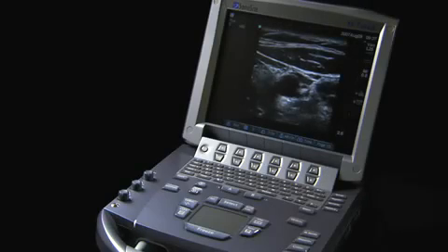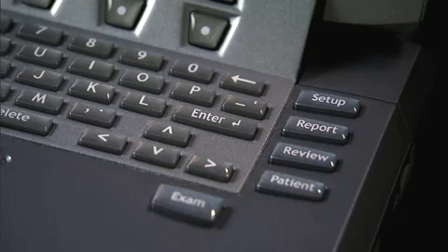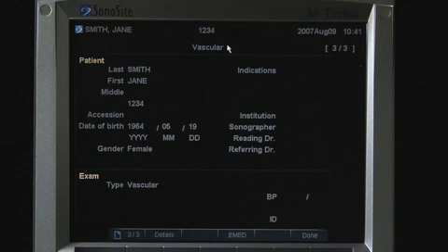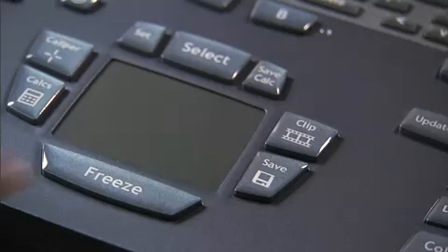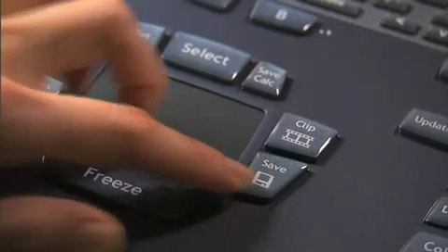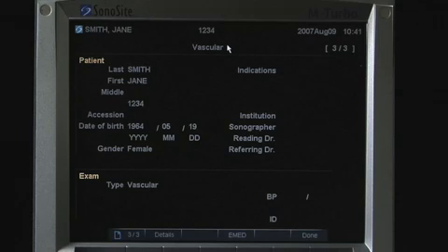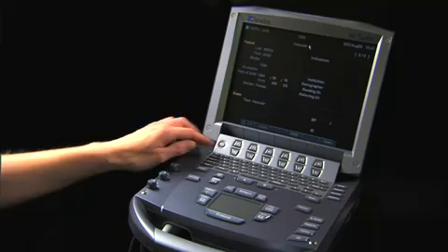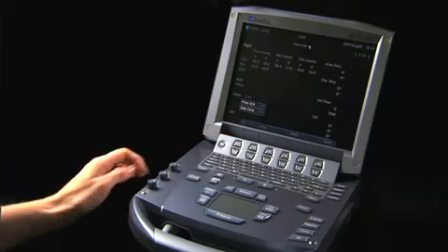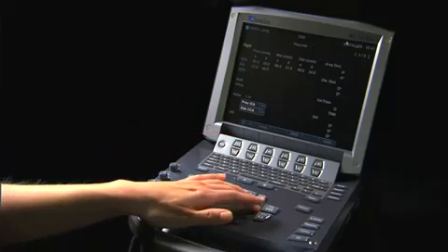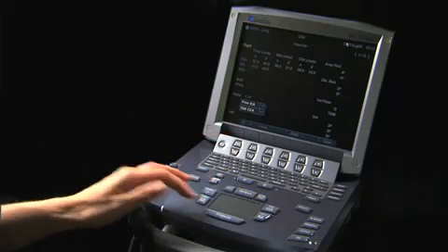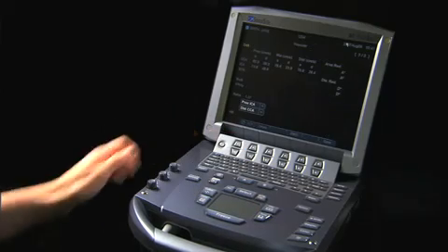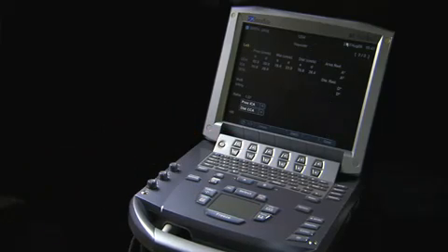To view a report of all patient data and measurements, select the Report key. This information can be saved with a patient exam by pressing the Save key. Each page of the report can be viewed by pressing the Next key in the on-screen menu. Save each page of the report to include with the patient exam information.